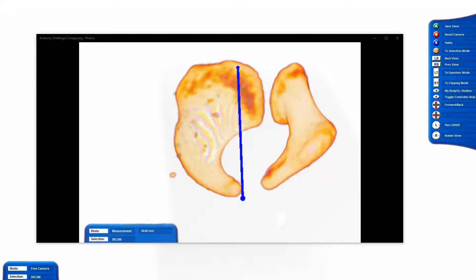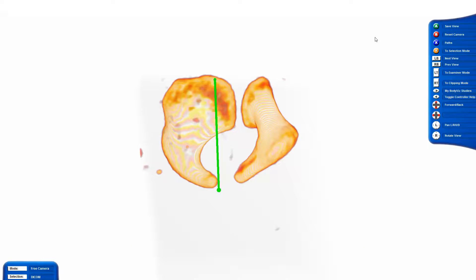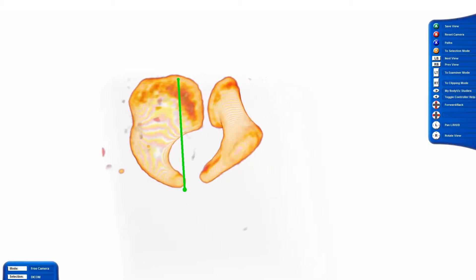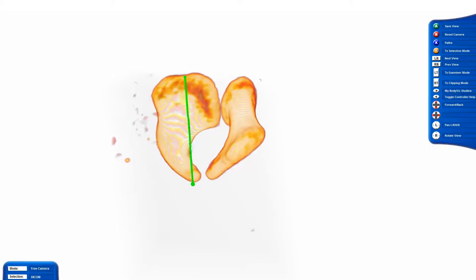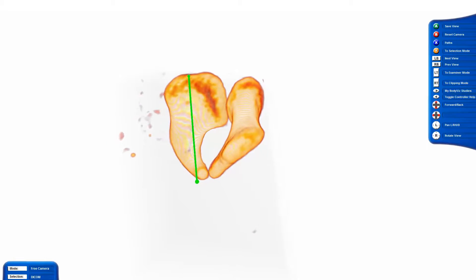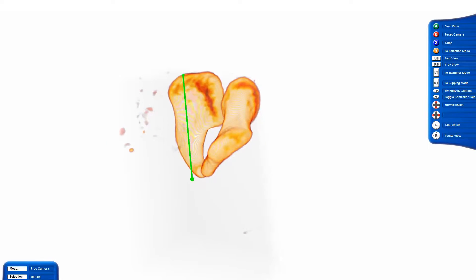In our question post, I asked viewers to identify these two bones. I have my CT study, which I will call a volume because it's displayed as a 3D visualization, already loaded up, and I'm in free camera mode. I'll use free camera mode to pan the viewpoint around these two bones to get a better look.